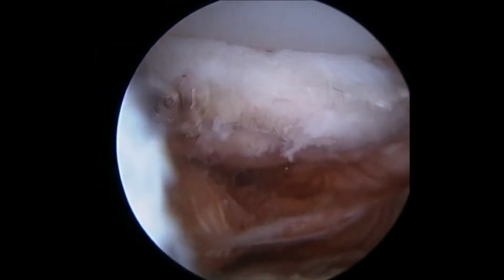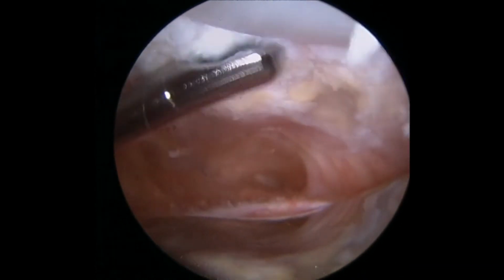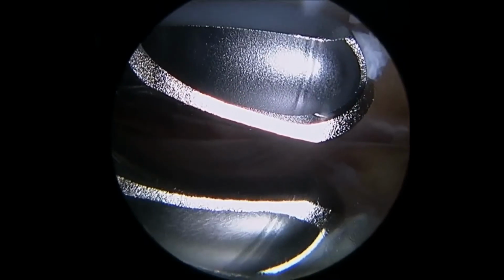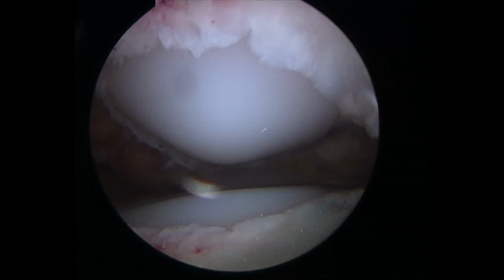So this is a resector. It's got suction on it, like a little vacuum tool, and it has little teeth. So we have to be careful that we don't ding up the metal and plastic, but we can remove all that scar tissue above the kneecap, and that's what we're doing right here. So this is above the kneecap in the area we call the pouch, the suprapatellar pouch, the pouch above the patella. So that's kind of after we cleaned it up.